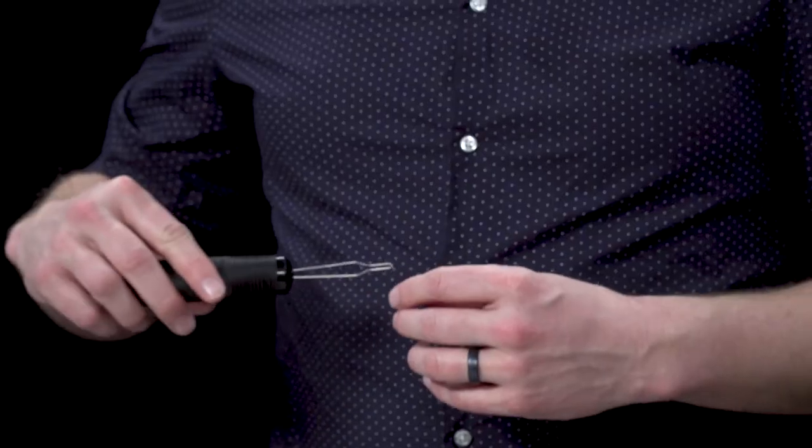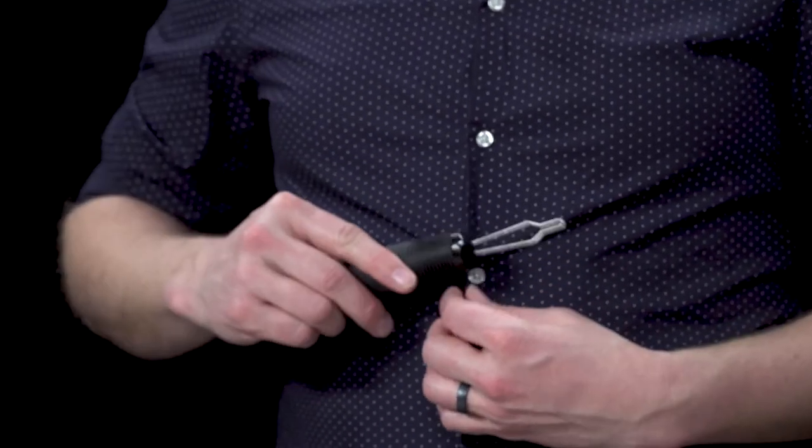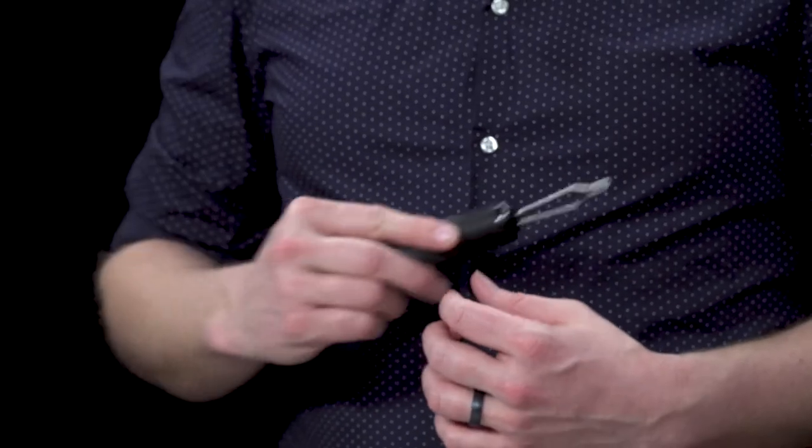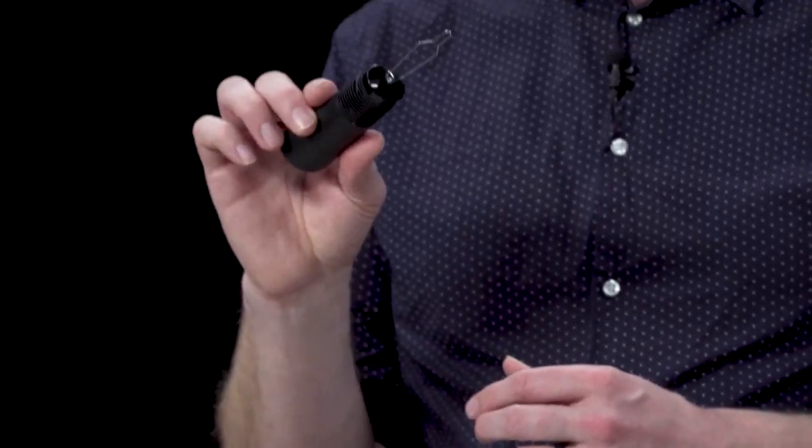But how this works is basically you thread, you can thread the button hook in and then pull it out. So you can just basically go in and out of the shirt buttons and using this to hold on to the buttons for you.